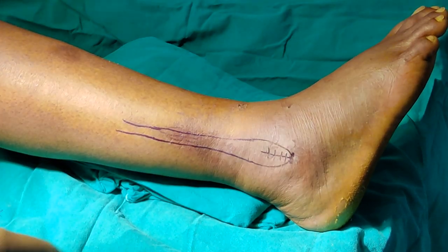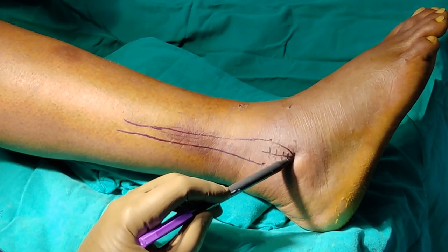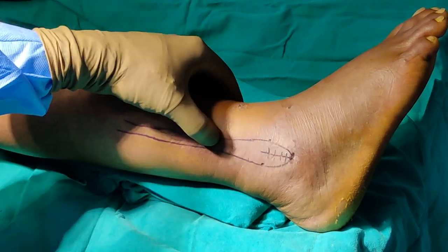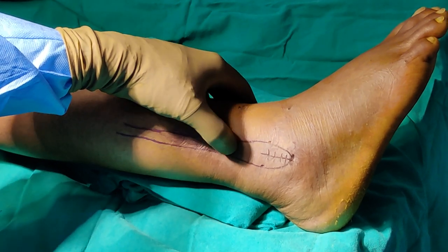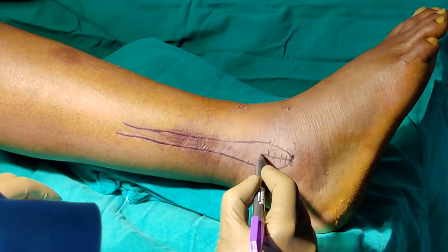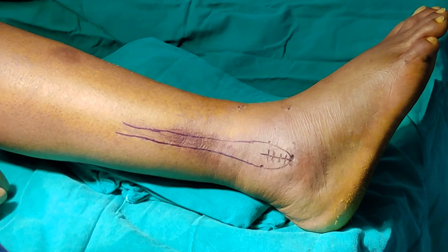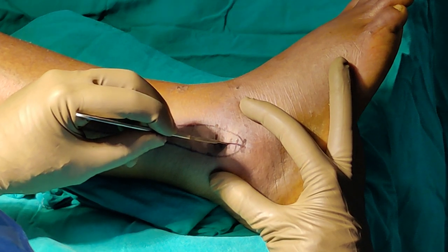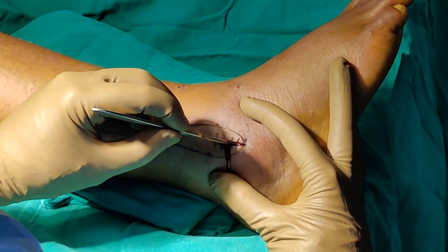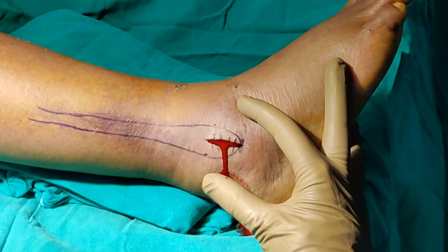I have drawn the fibula — you can see this is the front, this is the back, and this is the tip that we used the C-arm to locate. All you have to do is palpate and you will be able to feel the shaft. We will first make a small incision here to expose the distal fibula. The skin incision is pretty straightforward — just stay in the middle. Because we are not using a tourniquet you will expect some bleeding. Let us have a self-retainer.